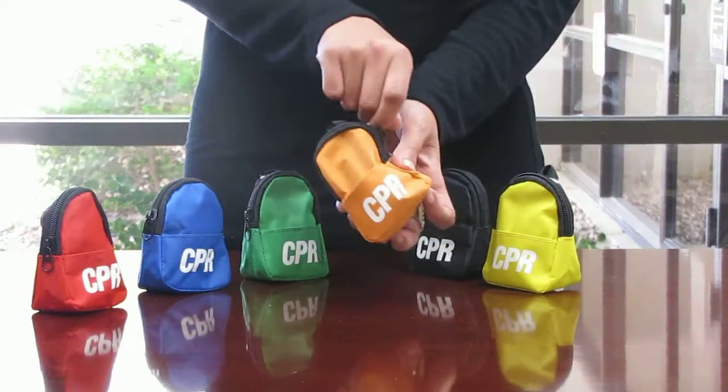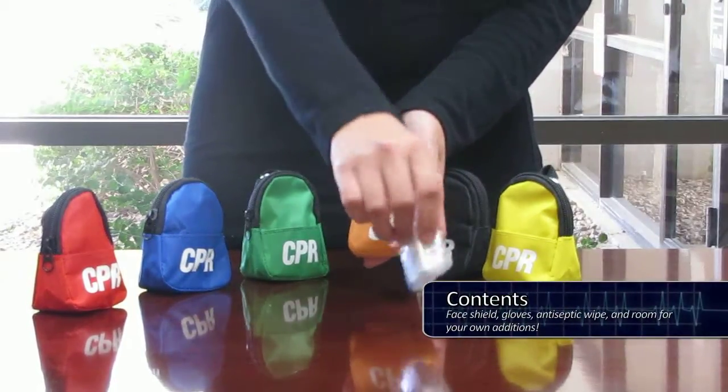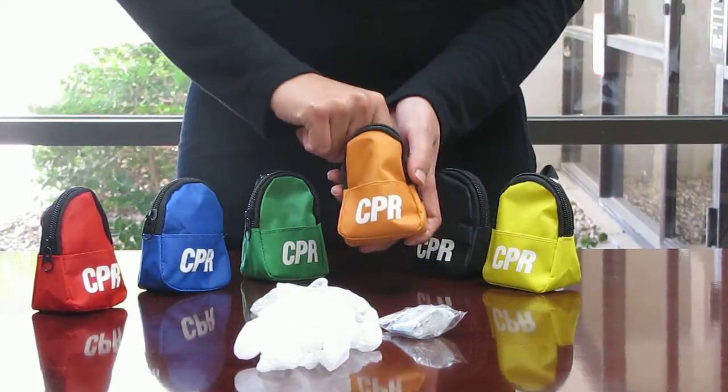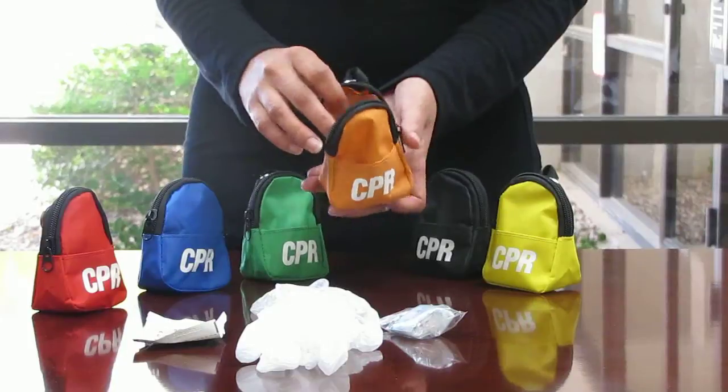As well as a zipper pocket. The contents included consist of a CPR face shield for protection during CPR, a pair of gloves, as well as an antiseptic wipe. And as you can see, there's still plenty of room for storage.